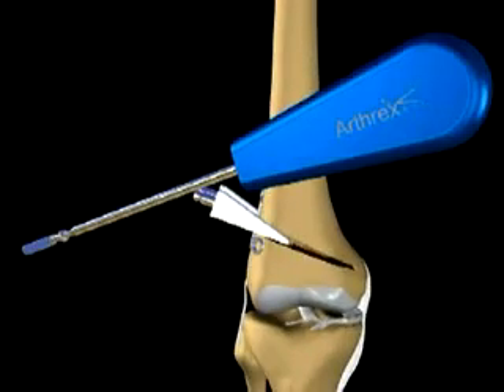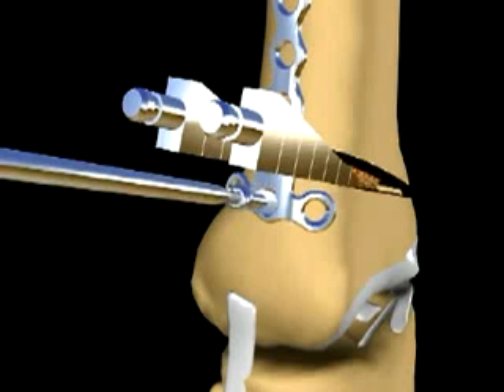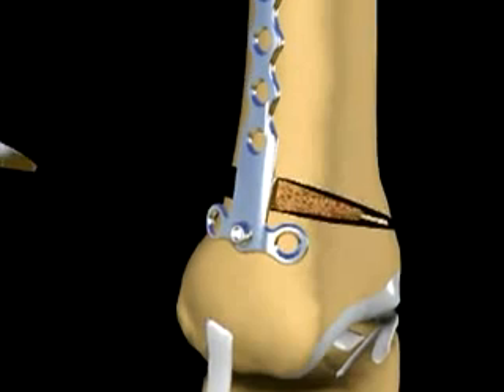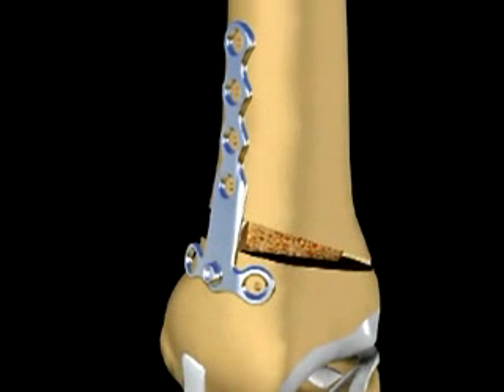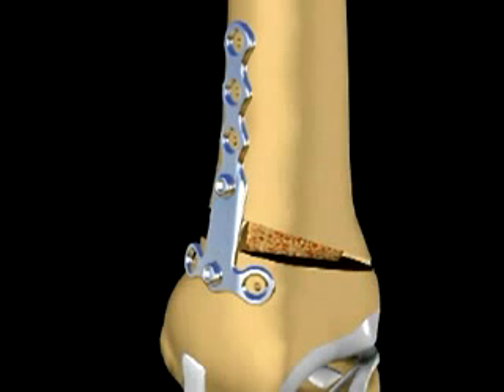Up to three 6.5 millimeter partially threaded cancellous screws are placed in the plate distal to the osteotomy. Four 4.5 millimeter fully threaded bicortical screws are used to secure the plate proximal to the osteotomy.